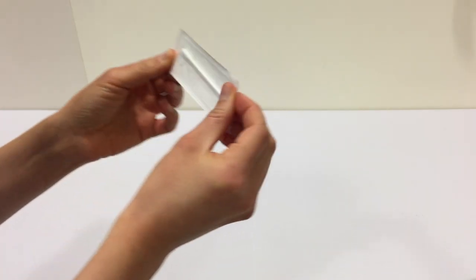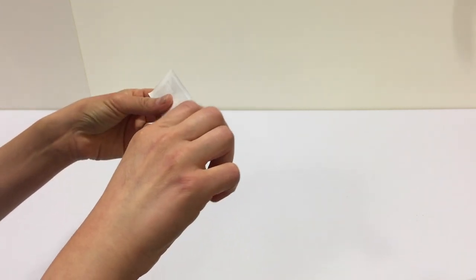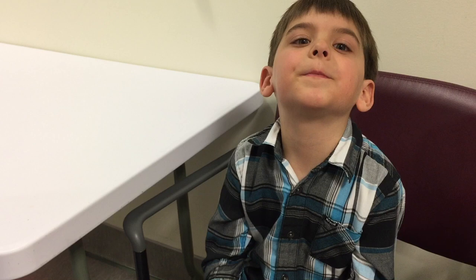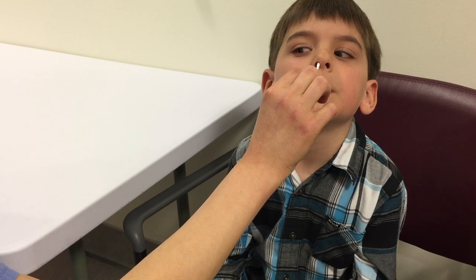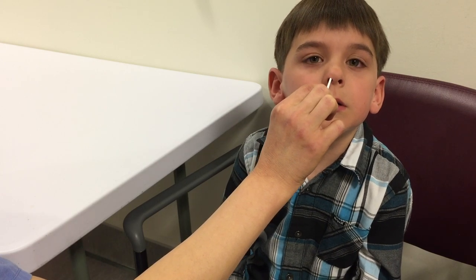You'll need to unwrap the swab, being careful not to touch the cotton tip. The swab will need to be inserted one to two centimeters into your child's nose. Follow the instructions on your rapid test for how many times and how long to circle the swab against the inside of your child's nose. Tilt your child's head back and put the swab up the nose at a slight angle. Insert the swab about one to two centimeters — about the width of a nickel — or until you feel resistance. Circle the swab around the nasal wall, then do the same thing on the other side.